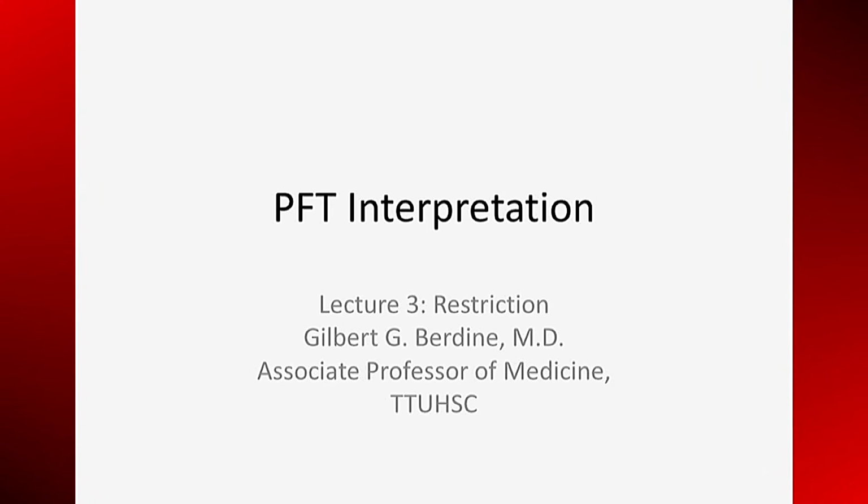Welcome to the third lecture on pulmonary function test interpretation. Lecture 1 covered the normal PFT. Lecture 2 covered airflow obstruction. This lecture will cover restriction.